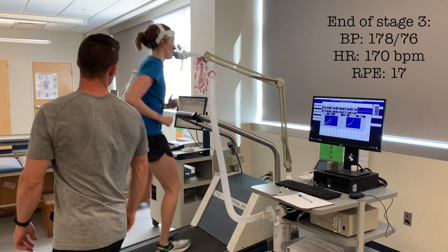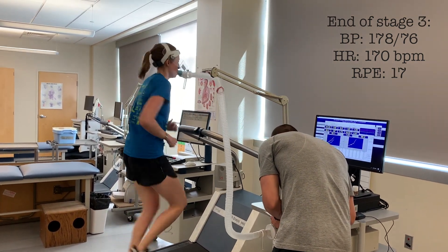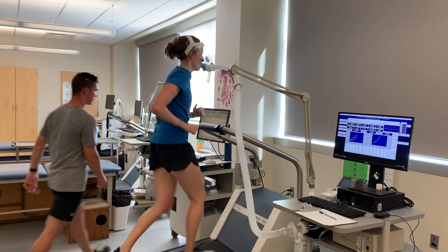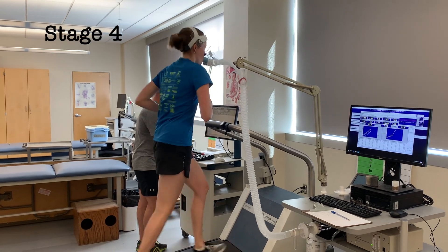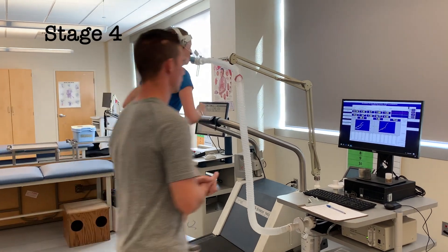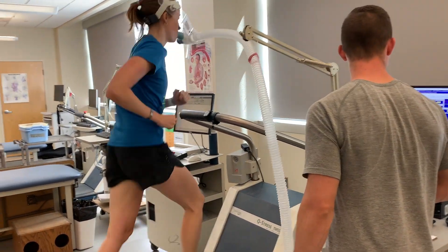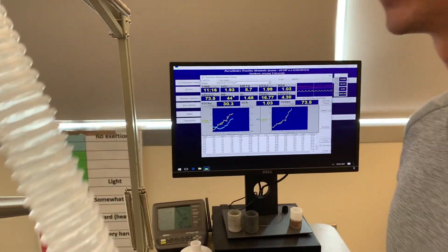What's your RPE? 17. Good job, keep it up, you're doing great. Heart rate is at 170. Okay, we're going to go up to the next stage: 4.2 miles per hour and 16% grade. Good job Betsy, keep it up. Here we go, you're doing great, keep pushing. Nice work Betsy, keep it up.